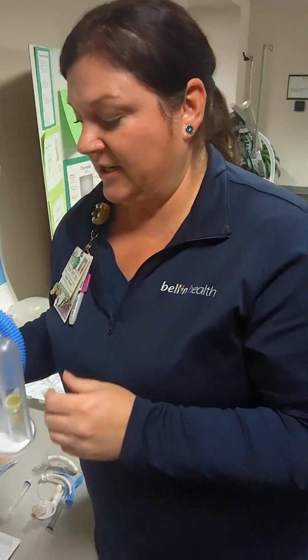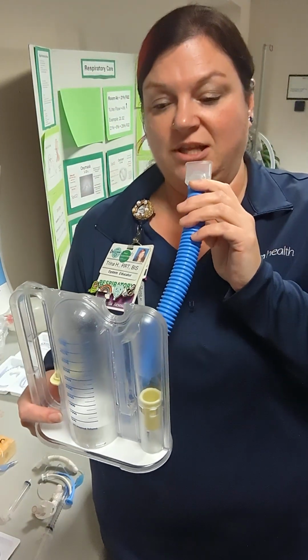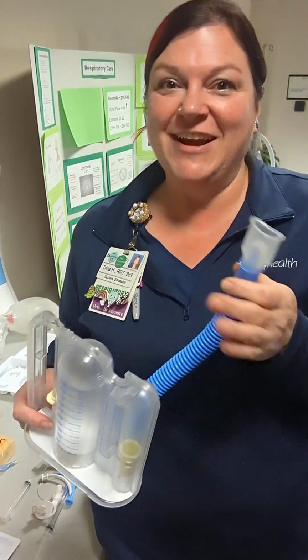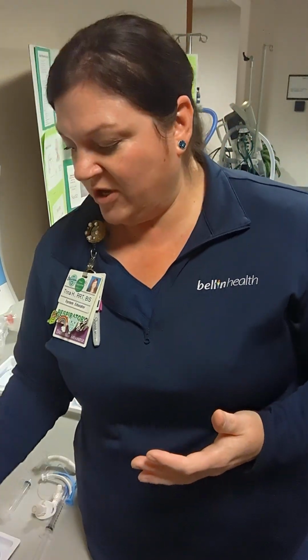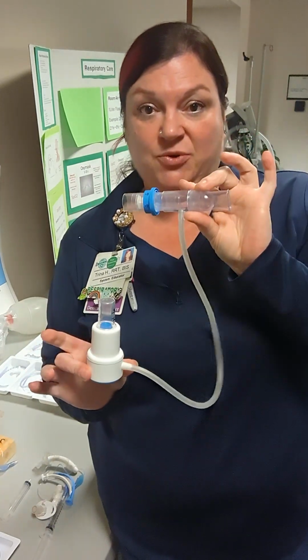If you ask your patient to take a big deep breath and they go like this, and you're like, okay, now try and breathe in. Okay, this is not going to work. You can talk to respiratory, you can give us a call, or you can talk to the doctor yourself, and we could utilize a device called PEP, positive expiratory pressure.